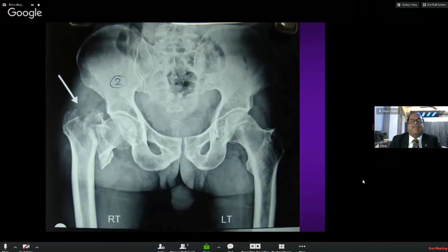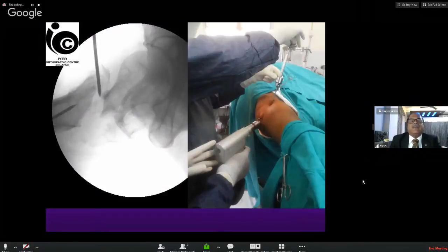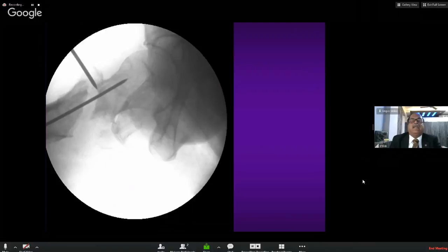So normally a fracture like this with a displace in lateral view, what I normally do is pass a K-wire into the lateral fragment or the outer fragment, not across the fracture site. Keep this ready. Then with the Steelman pin, I enter into the fracture site, which is passed from anterolateral aspect. Then once the alignment is obtained, the anterior cortex with the shaft is obtained, immediately the assistant will drive the K-wire which was kept ready. So wherever the K-wire goes, I pass it and fix the fracture with anterior cortex well aligned.